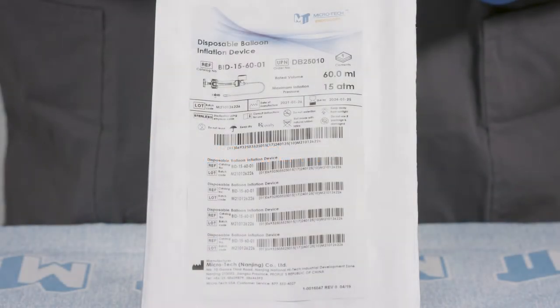The Microtec Disposable Balloon Inflation Device comes packaged sterile, one per box. The labeling includes the order number, date of manufacture, and use by date.